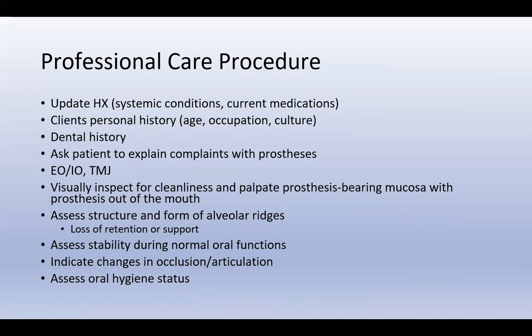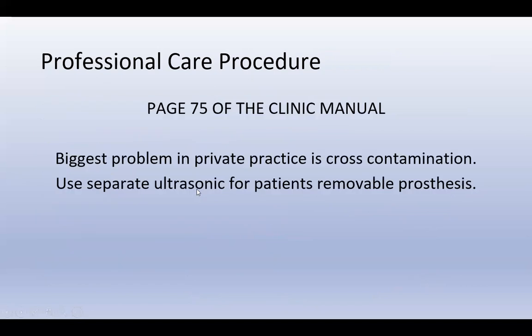Assess stability during normal oral function. So have them bite down on their denture and see, is it rocking? Are they biting in a good manner where they can actually masticate food? And then assess their oral hygiene status.